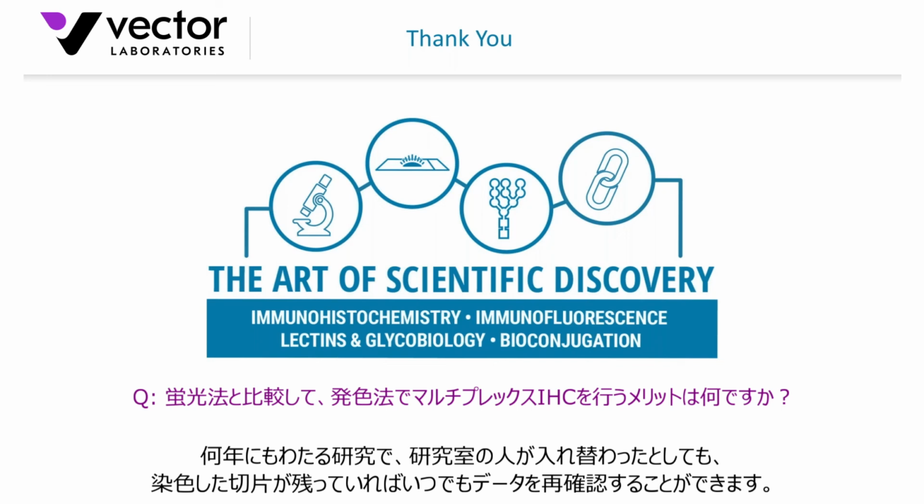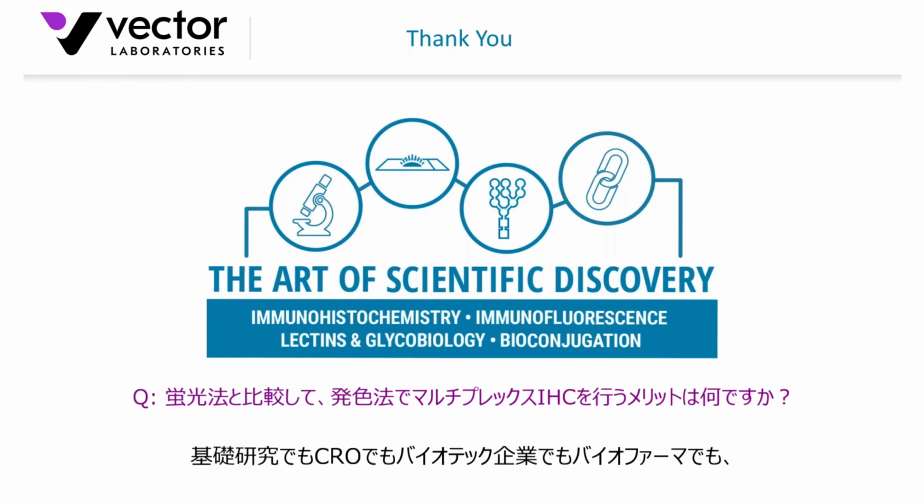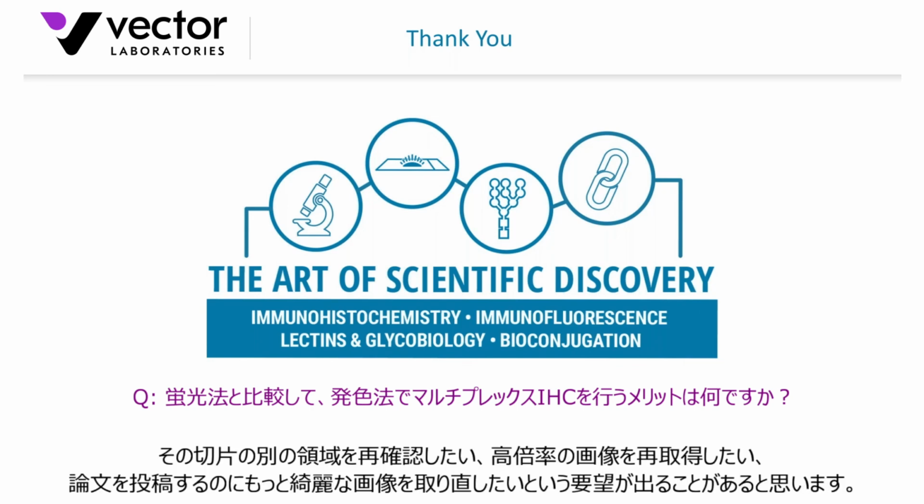Let's just say this is an ongoing study, stretching over years, with people coming and going in the lab. This is a research-based application, or indeed in a CRO, a biotech, a biopharma, and you want to go back and revisit that specimen, maybe different segments of that specimen. You want to take higher magnification images.